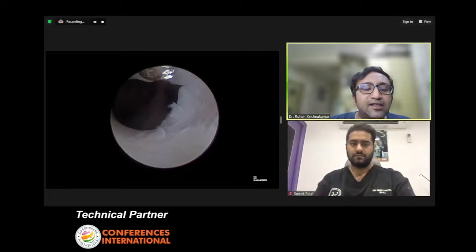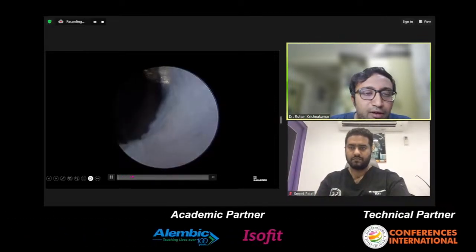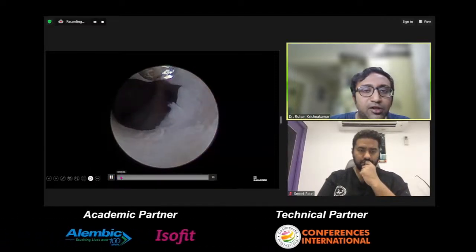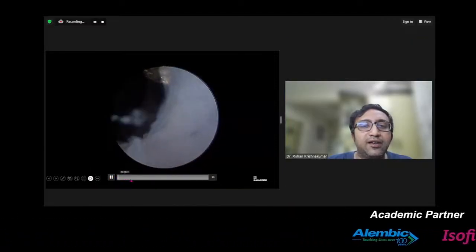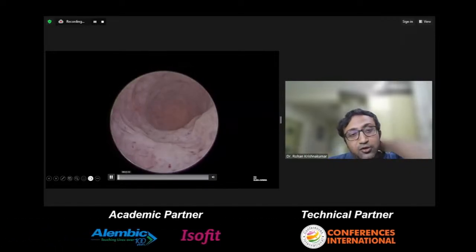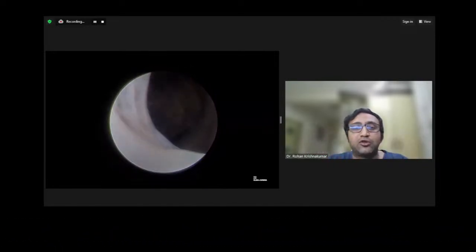Plus, this is a very interesting case. She had undergone 2 abortions, 41-year-old. She was shown to have a septate uterus. So we decided to go directly with a hysteroscope instead of giving her any mifepristone, misoprostol. We directly went in to diagnose what the pathology is.